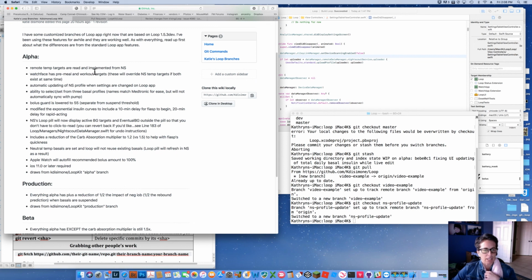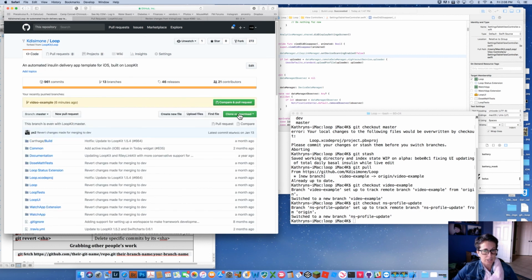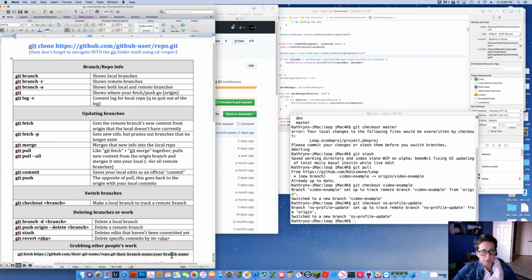But these are the customizations that my Alpha branch has. Remote temp targets are read and implemented from Nightscout, automatic updating of the profile. It has 3 basal profiles to select from. I changed my bolus guard, I changed all these things. So you could, if you wanted to, go here and download a zip of my Alpha branch, and you too could build with all of that if you wanted to. Or you could grab my branch.